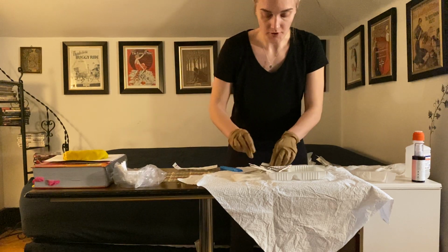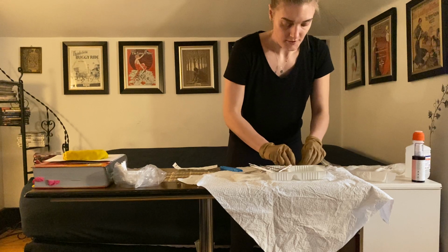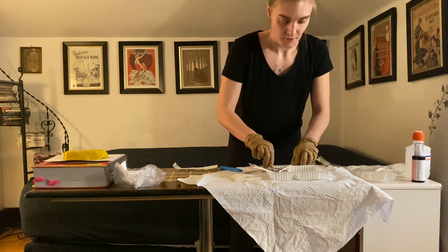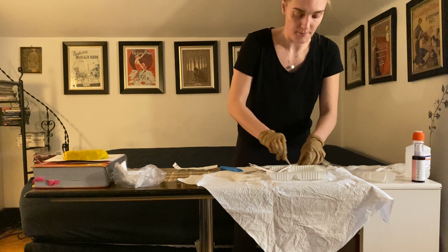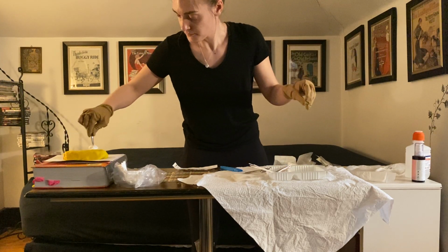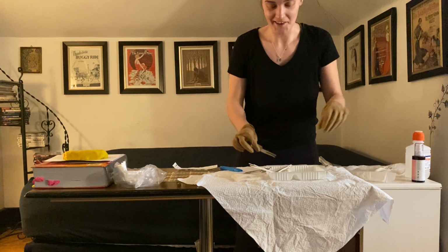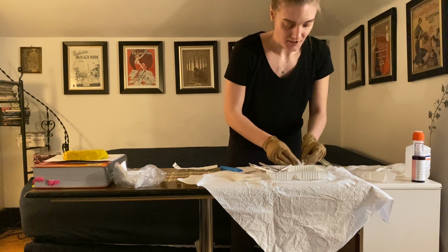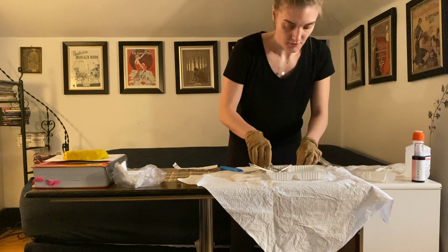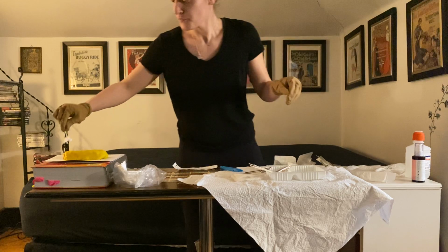Okay, and then I need to dry the peri wound. So I'm going to be making 2 more rosettes, and then still using that one swipe per wipe method. One swipe per wipe. So let's pretend that hit the garbage, and then again, one swipe per wipe to the other side.